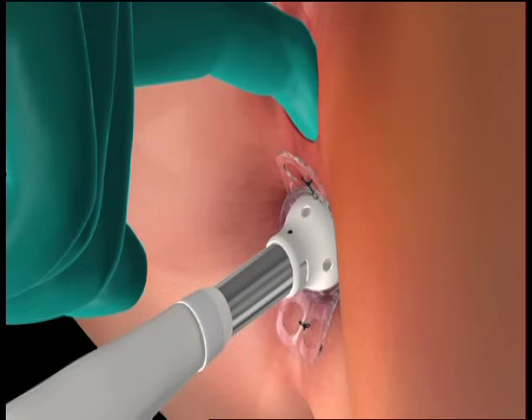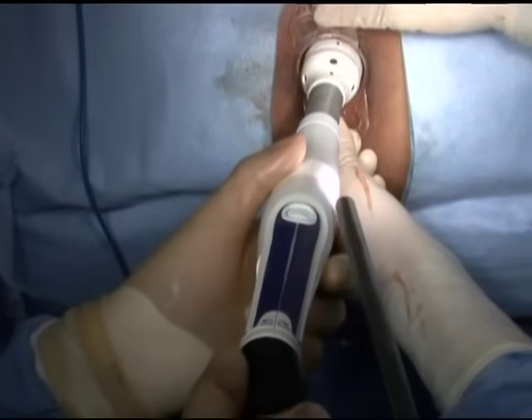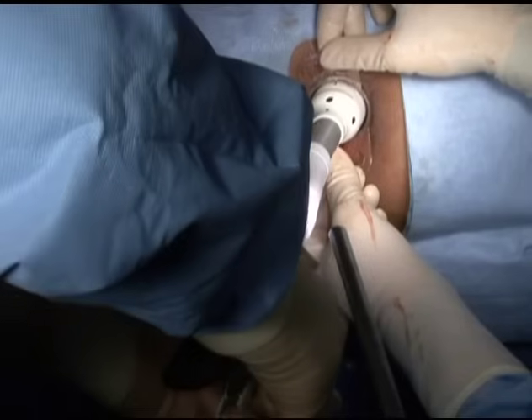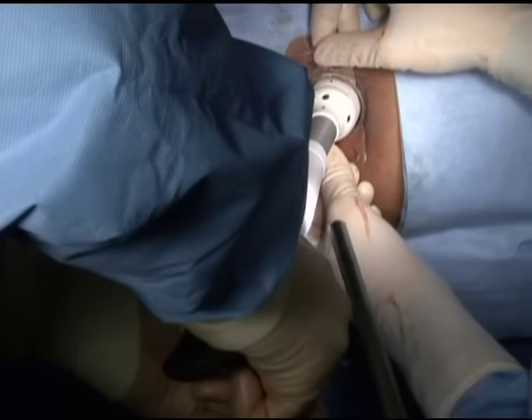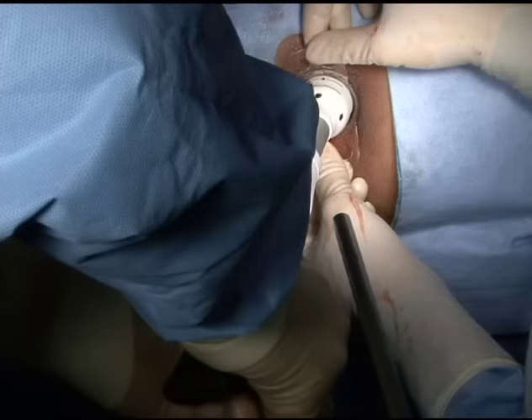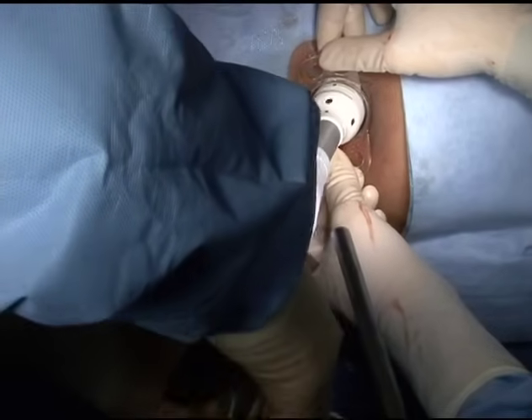For female patients, digitally inspect the tissues captured transvaginally to ensure that rectovaginal tissues have not been captured in the device. To fire the instrument, release the safety latch underneath the handle and squeeze the handle firmly until the handle contacts the safety latch. An audible and tactile click will indicate full firing of the stapler. Release the handle after firing and return the safety to the locked position.